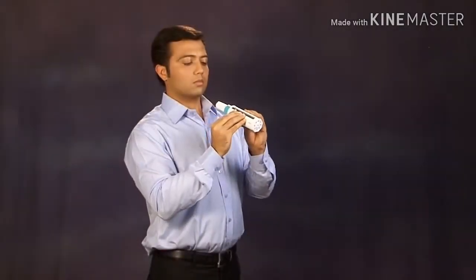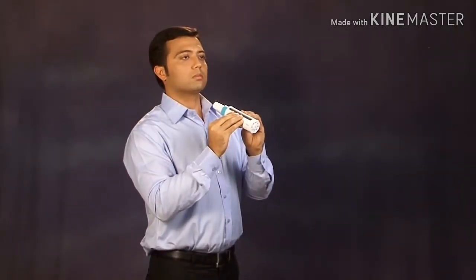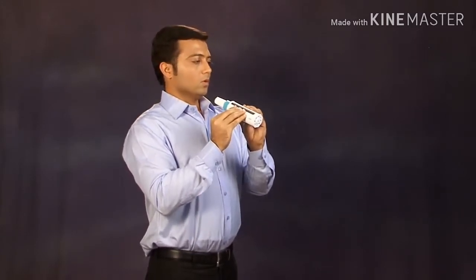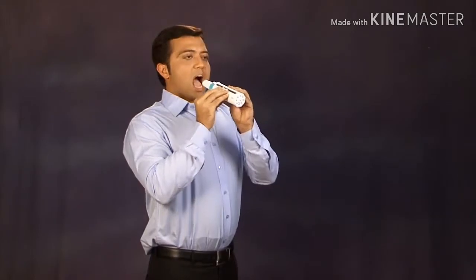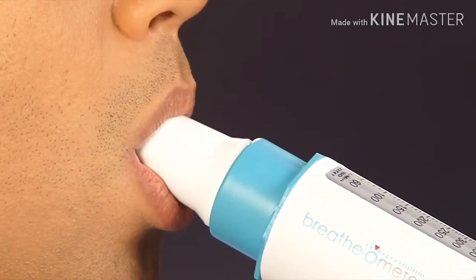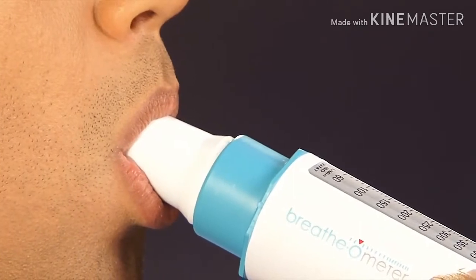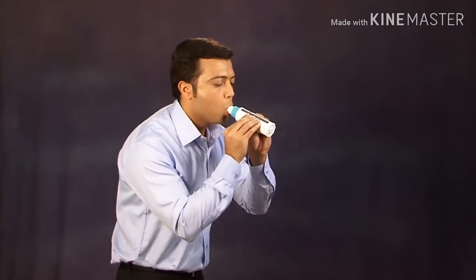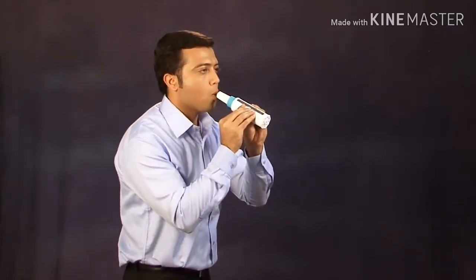It is better to take your PEFR reading while standing up. Breathe in deeply, then place the mouthpiece of the breathometer in your mouth between your teeth. Keep your lips closed firmly around the mouthpiece and blow out just once as hard and fast as you can.